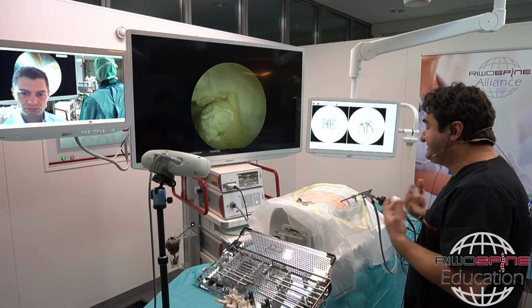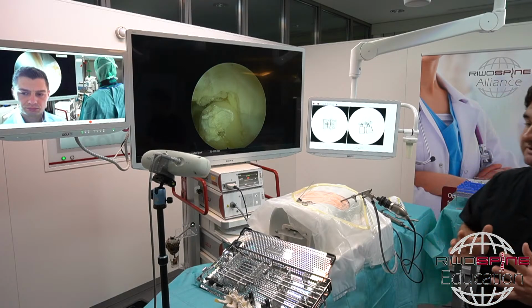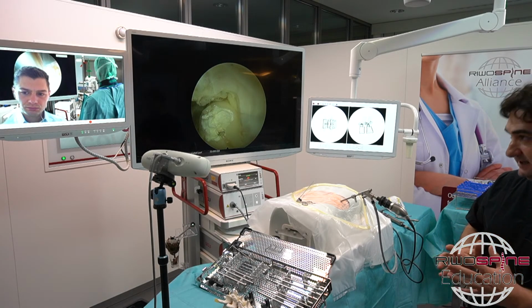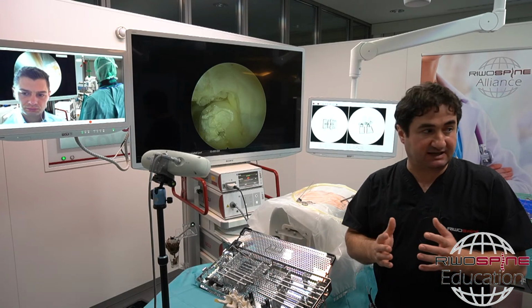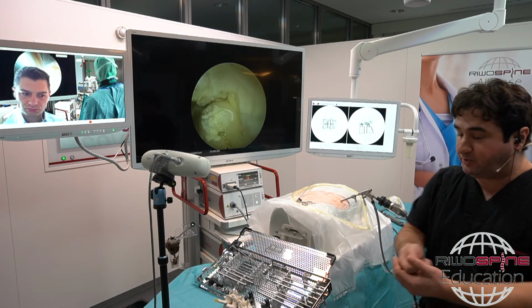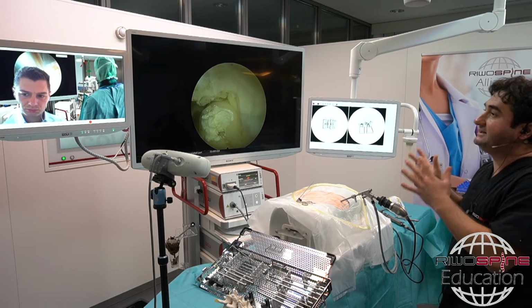The easiest case to start with, as I told you, you have to check the foraminal anatomy. Definitely, you need a space in the caudal side first. If you have enough space at the caudal side, you can do the regular transforaminal approach, which is very easy, and pull back the system a little bit outside of the foramen, then you can see the anatomy better.